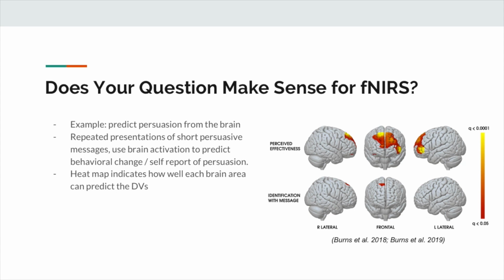We have systems where you can do what's called 3D digitizing, where once you get everything set up on someone's head, you can use this little wand that, I don't know the specific way it works, but you essentially just tap it to all the places on the head, and it registers those locations in real space. Then you can compare how well you did in lining up all the channel locations across people, and if you need to do any adjustment, it'll say from this person data was recorded here, and from this person it was recorded right next to it. So the second level that we're running in our analysis is going to have to handle data that we think is going to be averaged in between those or something like that.